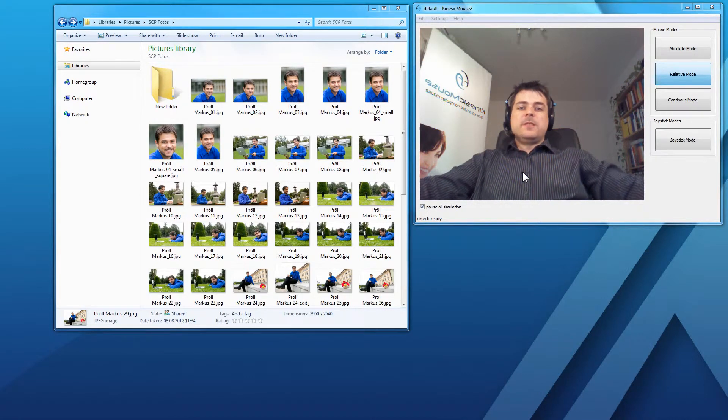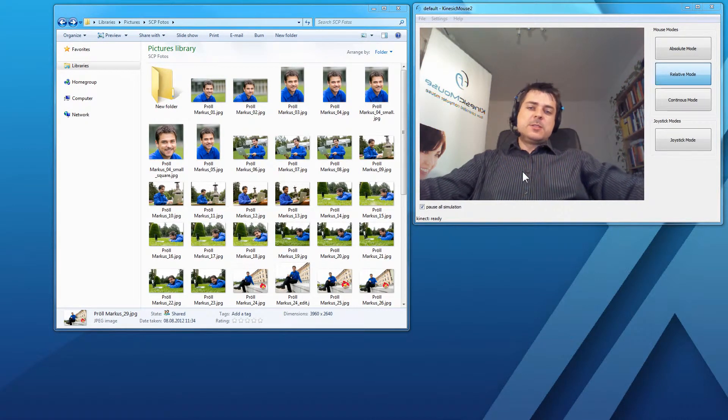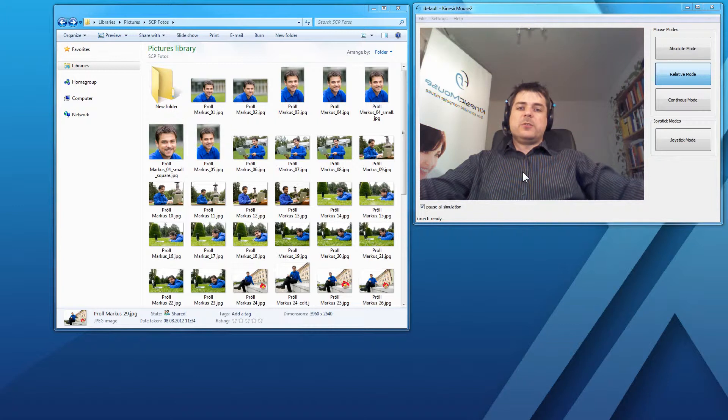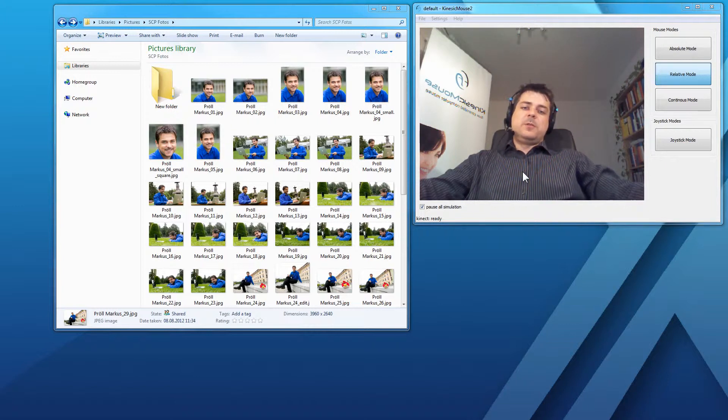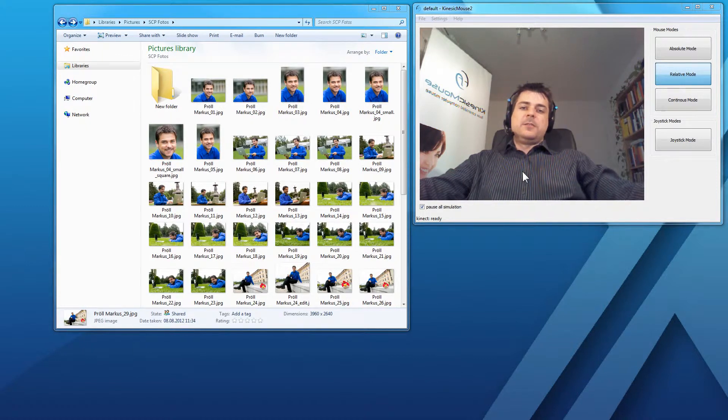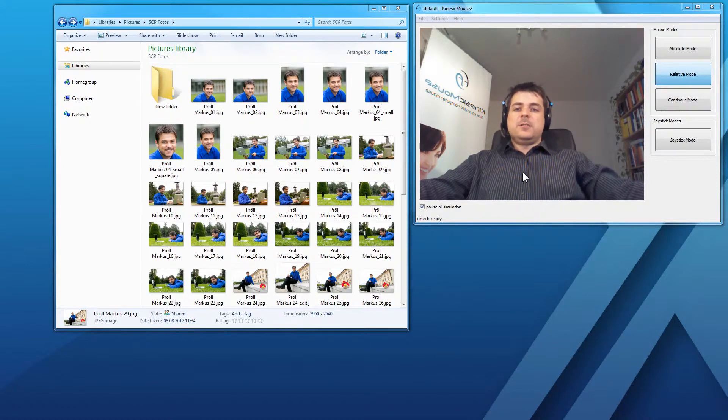Hi, we recently got a question from one of our KinesicMouse users about how to configure and set up the click and drag function. I will try to answer this in this little short tutorial video.